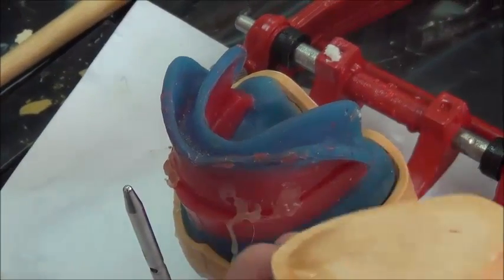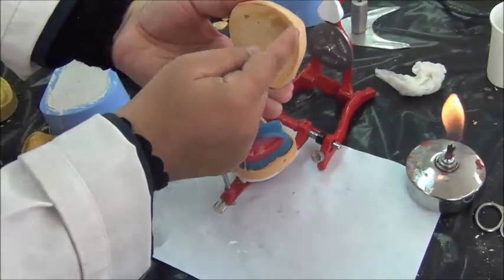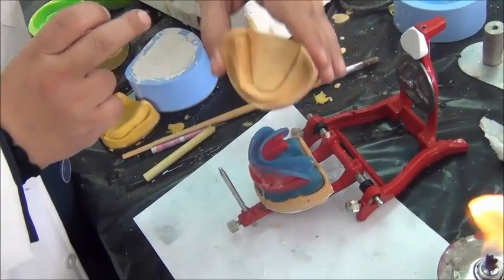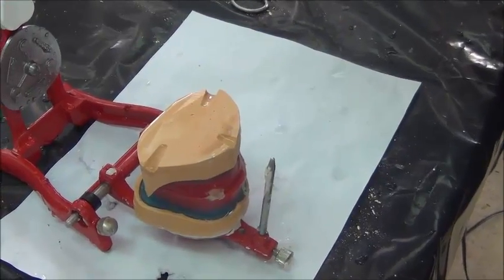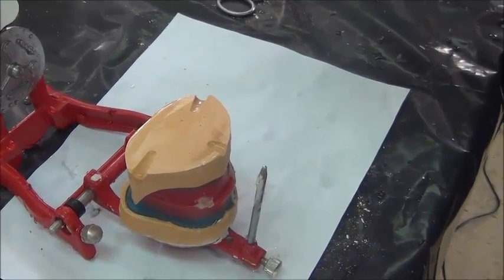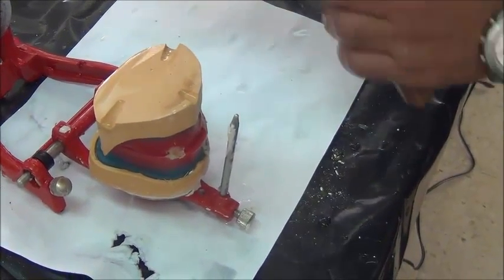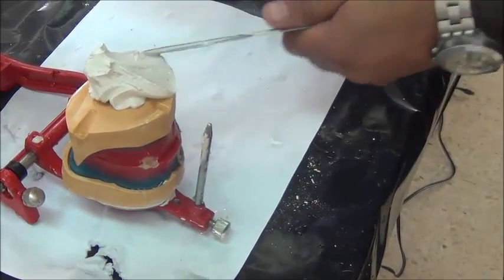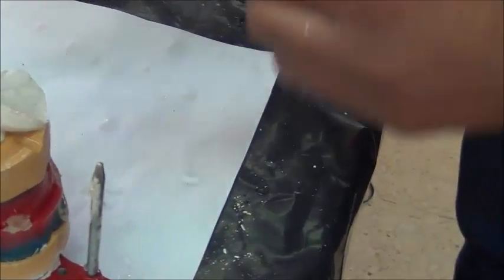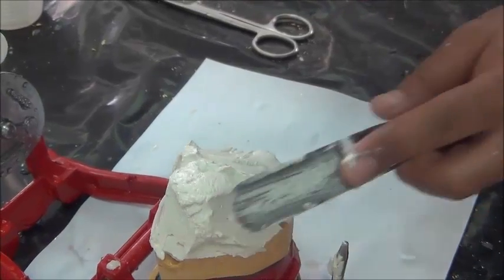For the lower cast, we're going to repeat what we have done in the upper. I'm going to soak this part, the base of the cast. I'm going to do the notches, 1 anterior, 2 in the posterior, and come back and put it into place and then begin mounting. Now, after soaking the base of the plate and placing the notches and making sure it's clear from the articulator, not hitting the member of the ring which is close to it, we add our plaster. So once more, we add it on the base. We cover the base. We make sure we go into the notch areas.